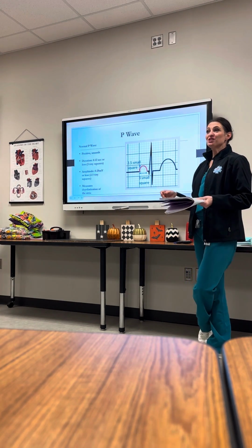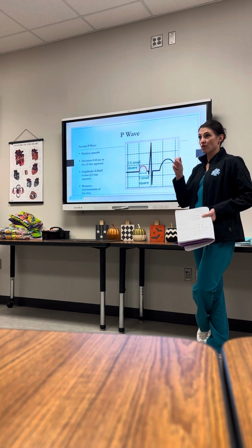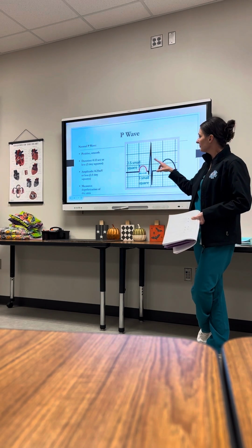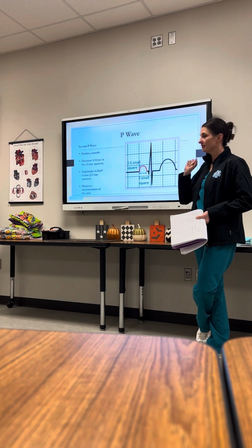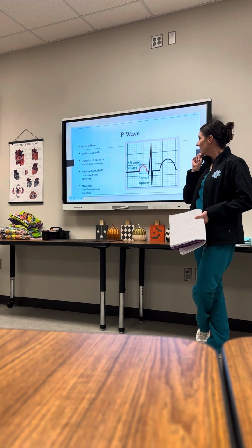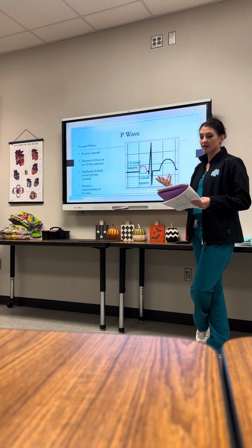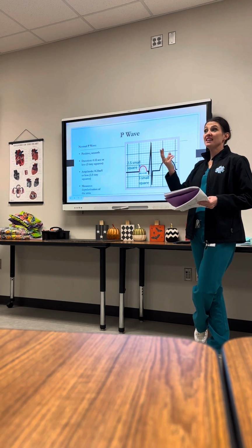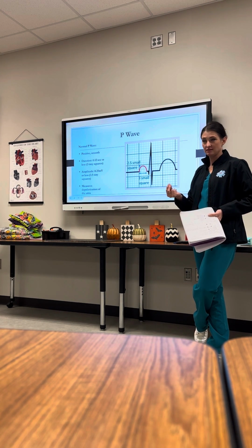All right, amplitude. This is the only wave that I'm going to give you a normal amplitude for: 0.25 millivolts or less for a P wave. And what are we measuring in the P wave? We're measuring the depolarization of the atria.